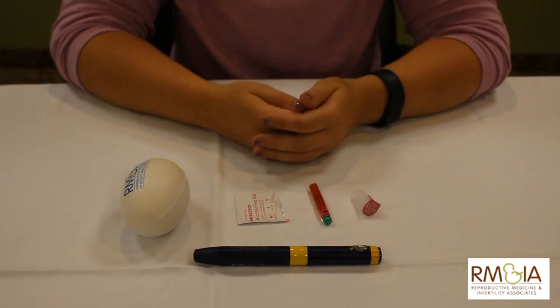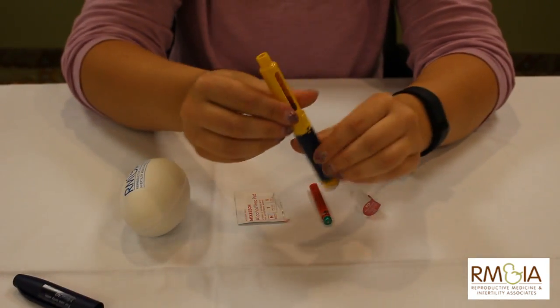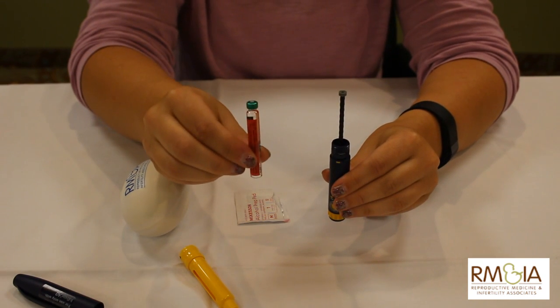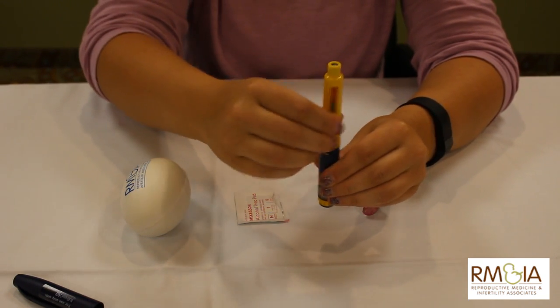This is our informational video on injection teaching. To start with the Follastem Pen, take off the cap and unscrew the yellow piece. Take your cartridge of medication, place on top, and reattach the yellow part.